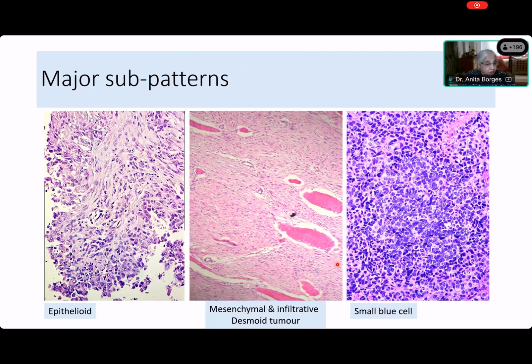All right, let's ask your colleagues now. Navneet, will you pick out the poorly differentiated tumors in these three photographs? Ma'am, first and third. Okay, Navneet. Sakshi. Ma'am, they all are poorly differentiated. We cannot type the tumor based on it. So you think all of them are poorly differentiated? All right. Aradhana. All are. Okay. Amrita. All, ma'am. All the three. Okay. Deepak. First and three. First and third. Aishwarya. Ma'am, I think just the first one is poorly differentiated. Only the first one. Okay. And Sneha. Ma'am, first one is poorly differentiated, and the others are not poorly differentiated.